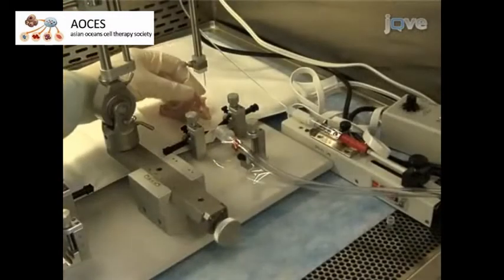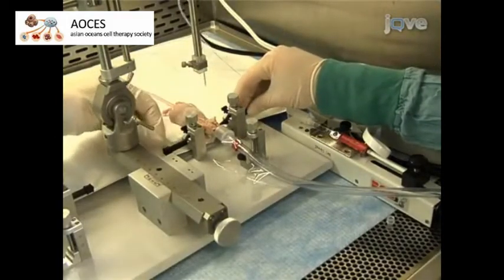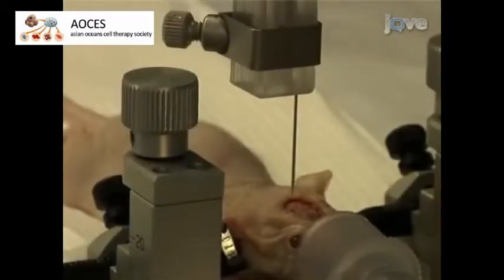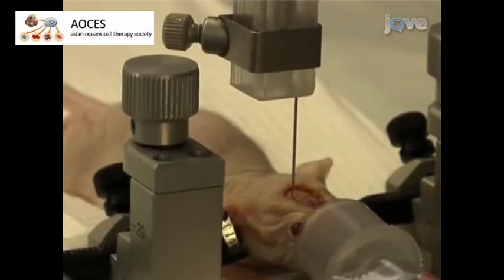At this point, transfer the mouse to the stereotaxic frame and begin administering inhaled anesthetic at a low level. Carefully monitor the mouse for changes in respiration rate, adjusting the anesthetic accordingly. So this next step is probably the most difficult aspect of the entire method. When placing the cannula, be sure to center it over the hole. To do this, check the cannula placement from all angles. Next, position the cannula over the skull hole and then lower 3 mm below the skull surface.